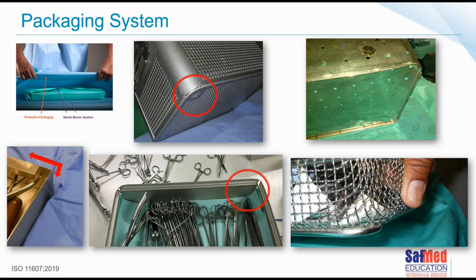Or we've got this older type of tray systems. I don't see too many of those around anymore where the weld sometimes breaks down on the side, or any form of sharp edges. And of course, those sharp edges could also apply to bowl packs or receivers or all sorts of items that develop sharp edges over time with use and with deterioration.